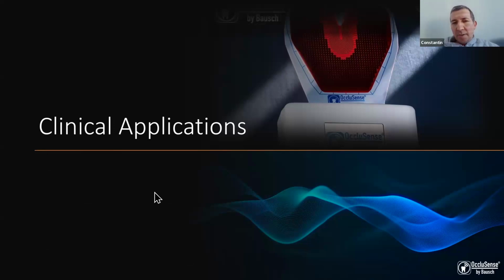How do you correlate the contact on the system with the contact in the mouth? How do you know that? Can you say exactly which point on the tooth is the red point on the occlusals? Through the color transfer.